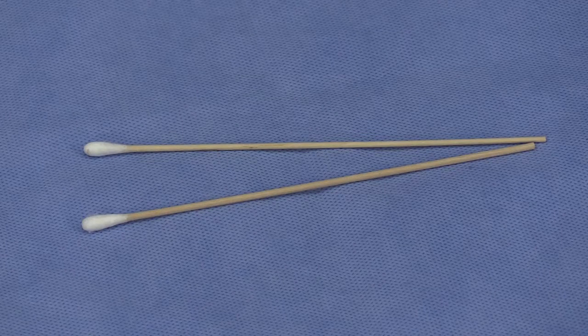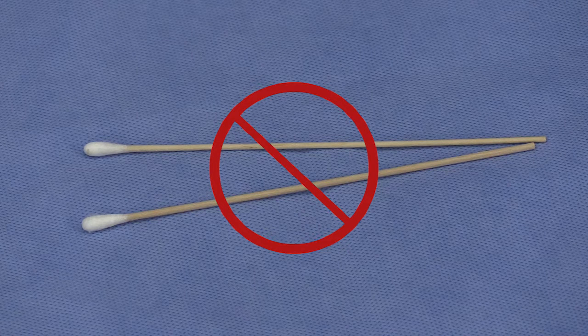For example, wooden shafted cotton tip swabs should not be submitted as they may produce false negative results. The pathogens tend to remain adhered to the cotton fibers.